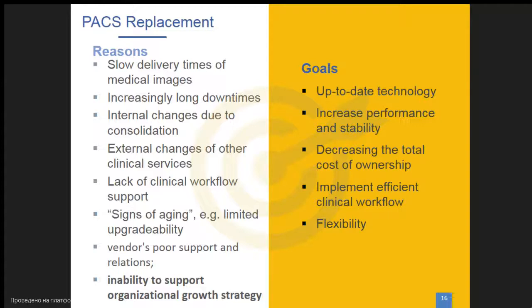There might be external changes of other clinical services because of new departments of cardiology, invasive cardiology, or radiotherapy, which also need imaging. There might be a lack of clinical workflow support, signs of aging, and especially important, if PACS is unable to support the organizational growth strategy, then it's the reason to change it. The goals.